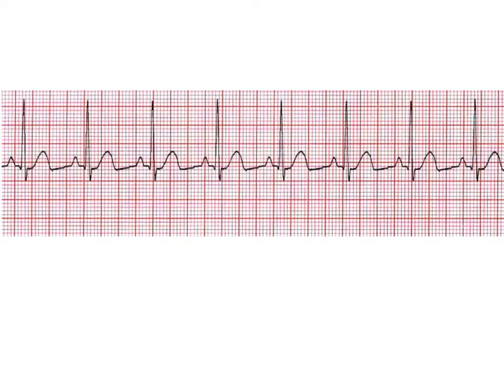What's up, guys? I hope you guys are ready for another round and ready to rumble with electrocardiography yet again. What I want to look at today is going to be waveforms and identifying just the common waves that you see on an EKG, what you'll be running into day to day.